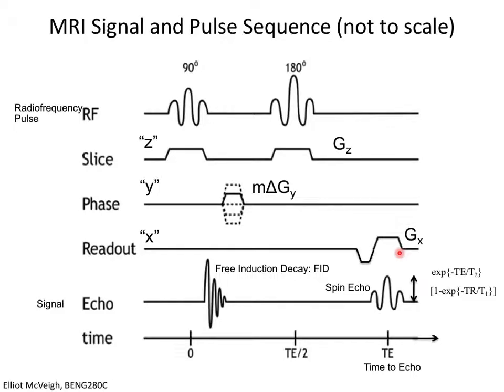So as that X-dependent phase shift changes, you measure a signal here. And that's equivalent to saying, I will measure an oscillation of a magnetization vector at one frequency and another frequency over time.